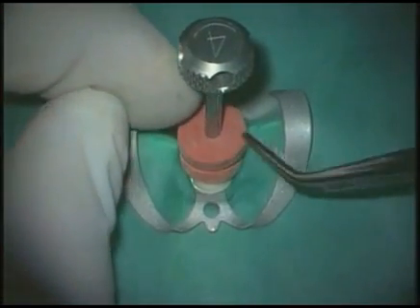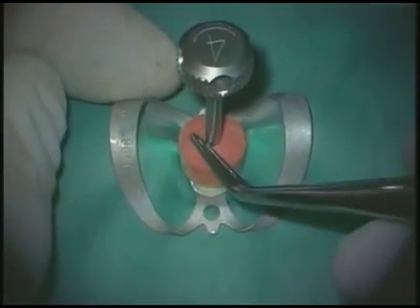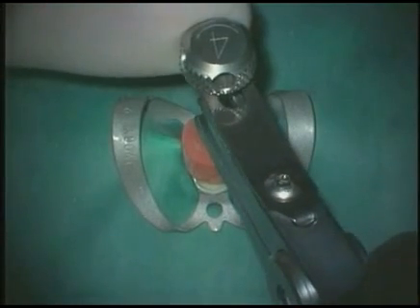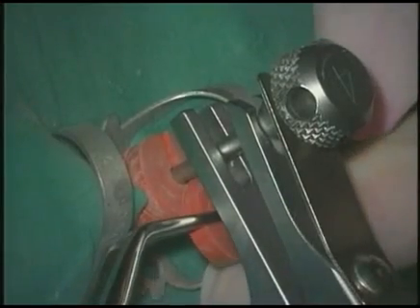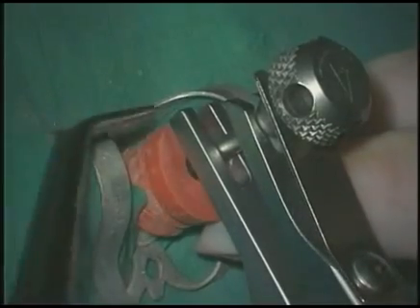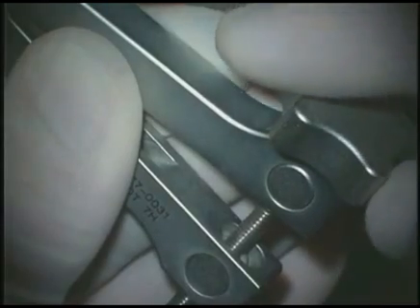As usual, we'll use the protective bumpers. Notice with the proximity of the adjacent teeth and their incisal edges, we're using a second, and sometimes we'll find out as we begin to insert the extracting plier that we might even need to place a third one. This will kick the lower jaw further away from the adjacent teeth so that we can introduce the extracting plier safely. Slowly and progressively turn the screw knob.